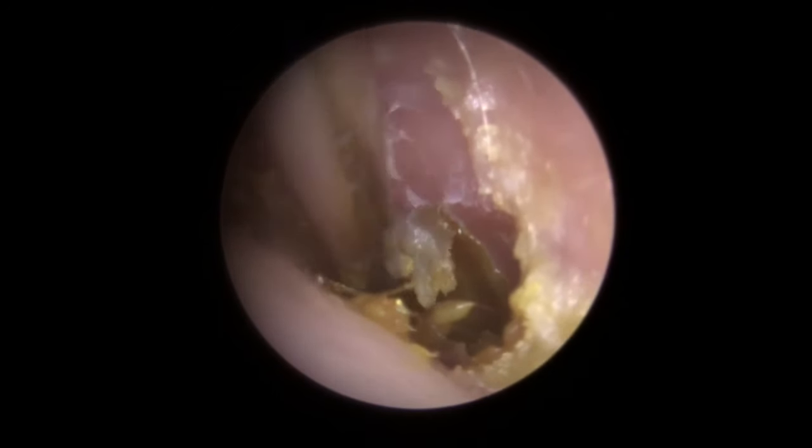Because the last thing we want to be doing is pulling if we saw any flexion to the eardrum. Keep an eye on the bottom right-hand corner — I can see there's a little ridge there, and I think that's the best way in to get this peel. I've got to very carefully guide this suction tube between the eardrum and the canal wall, get a grip on that very narrow section, and start the peel. See it peeling away — I've slowed it down. You can see the olive oil has got underneath it, and it's helping the peel along. Because once the olive oil gets behind it, it loosens all the way along. Starting to get the good peel — we've uncovered that right-hand corner of the eardrum, slowly peeling across.